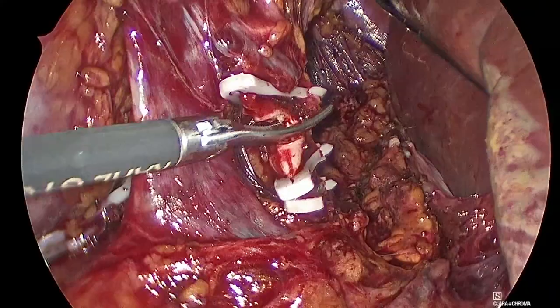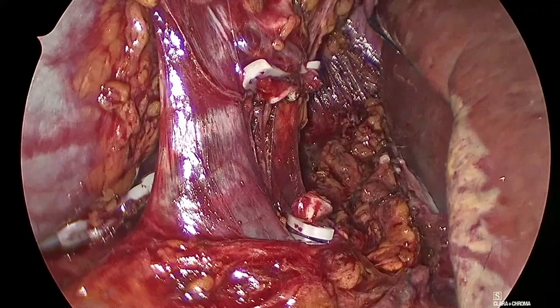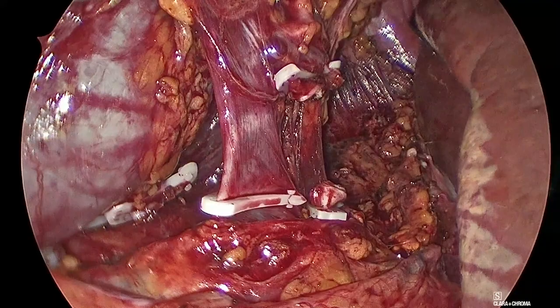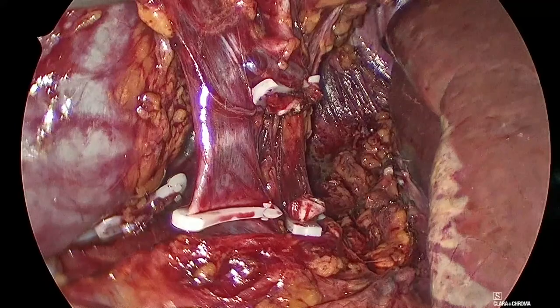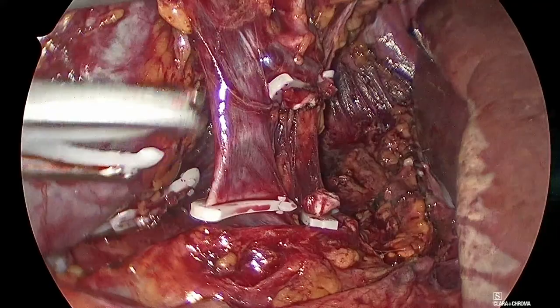All right, so now I think that this is all good to go. Hemoloc. Another one.